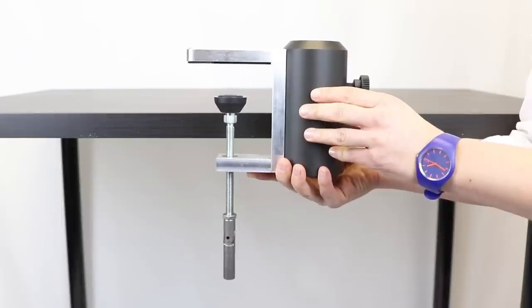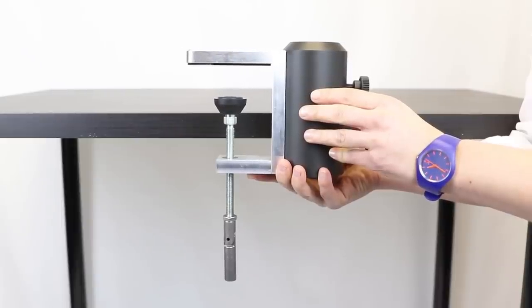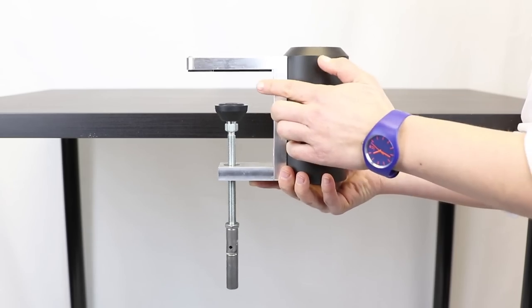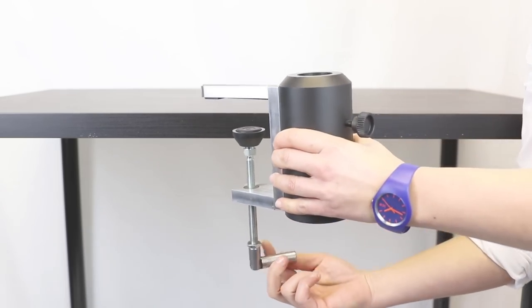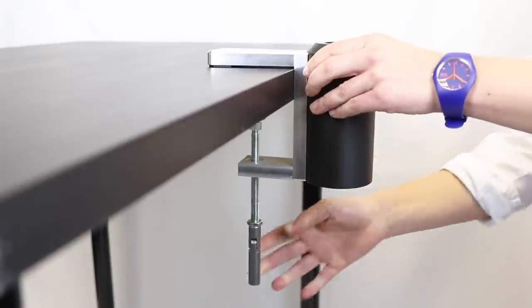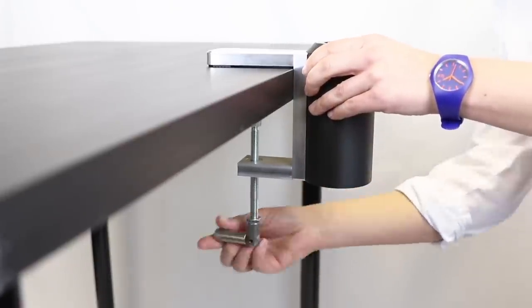You want to have a sturdy table with no lip underneath. Undo and widen the gap. Slot it onto the table and make sure you tighten the handle underneath.